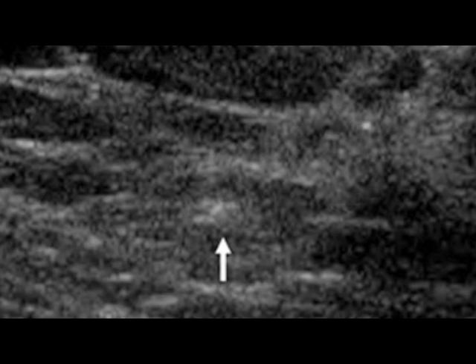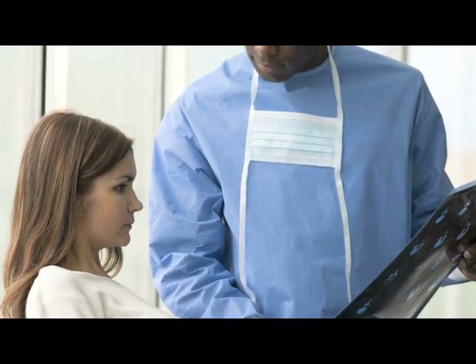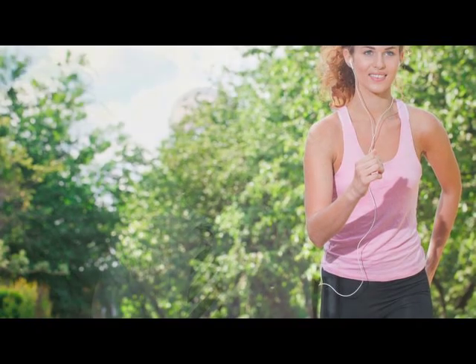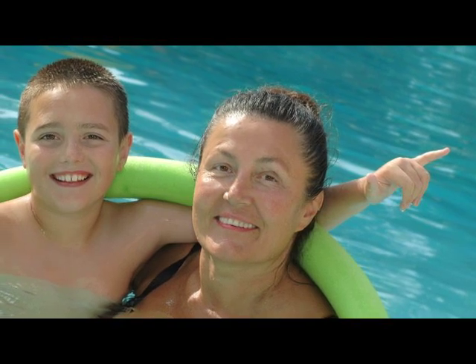Following the biopsy, a small marking clip usually composed of stainless steel or titanium is placed in the region of the biopsy. This marking clip remains in the breast tissue following the procedure. If you require any additional surgical procedures based upon the results of the biopsy, this clip will be used by the surgeon to guide him or her to the region. If no additional procedures are required, this clip will remain within the breast tissue and will be seen on future breast imaging tests. You will not be able to feel this clip, it will not move within the breast tissue, and no, it will not set off metal detectors at the airport.